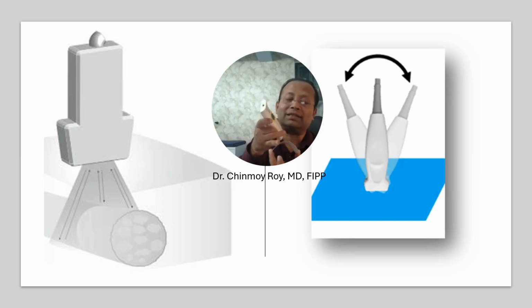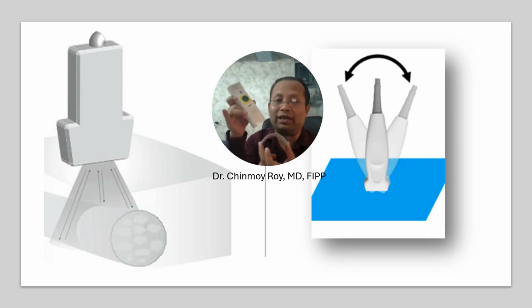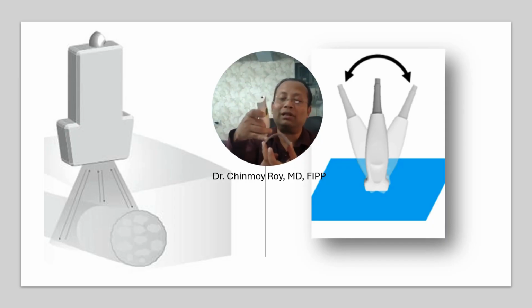So this side and this side will be shown as hypoechoic, whereas the whole length of the structure is similar, and there is no pathology at this side or this side that should make it hypoechoic in comparison to this central part. So to see this part also hyperechoic, we have to do one maneuver.